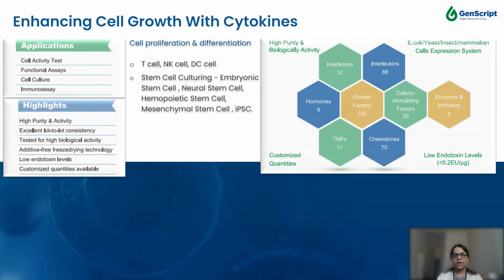Another very important reagent, or key ingredient, used in the cell therapy process after or during activation is for the expansion of the cells. Recombinant proteins, including cytokines and growth factors, are very necessary materials used during expansion or activation.